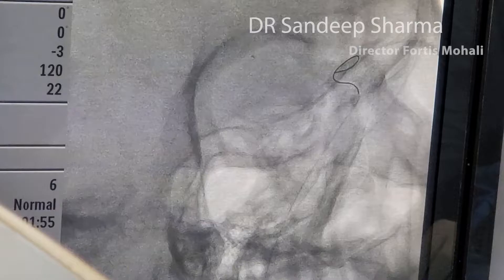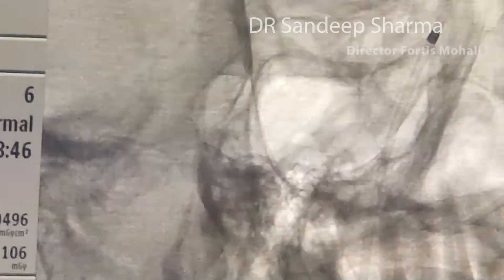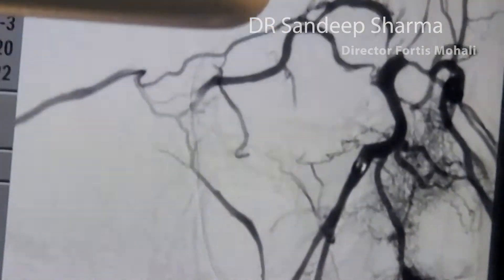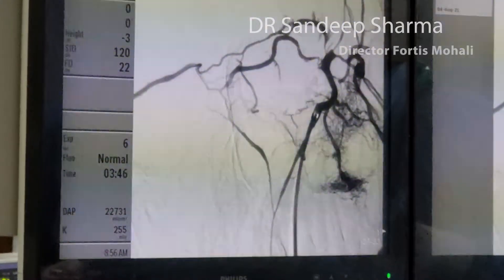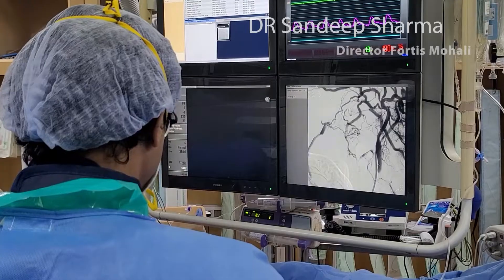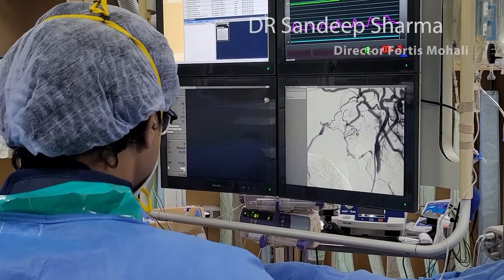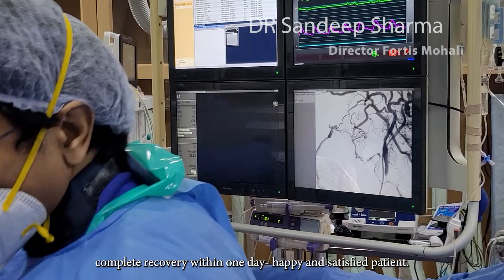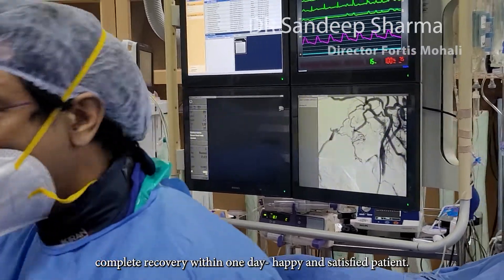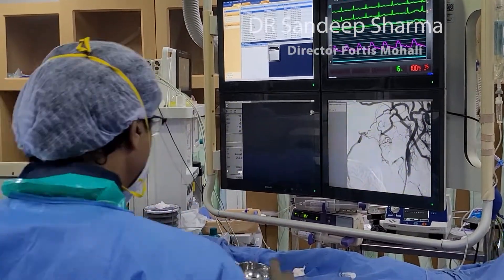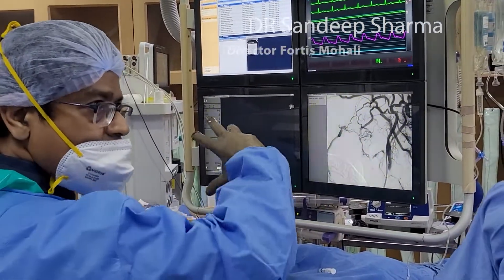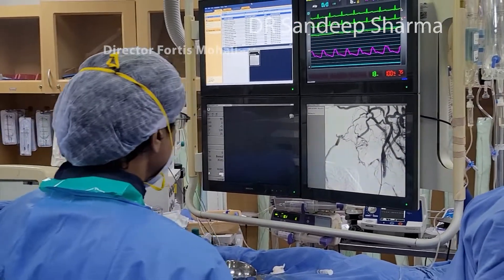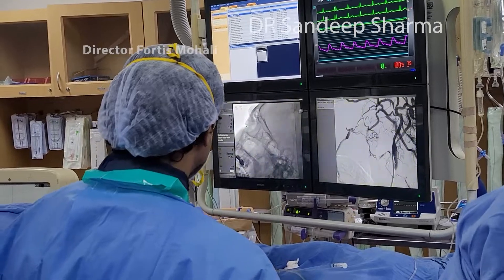This has to be done slowly. After that, we don't push over the dilator — then we push in the 5 French sheath. So this is the 5 French sheath which is now in the facial vein. We're trying to get a 3D view now, or at least rotate it.